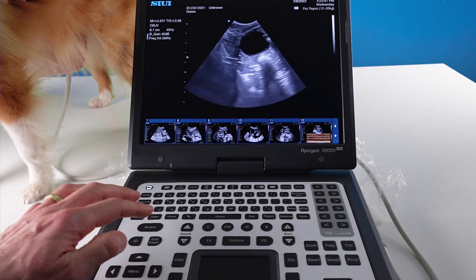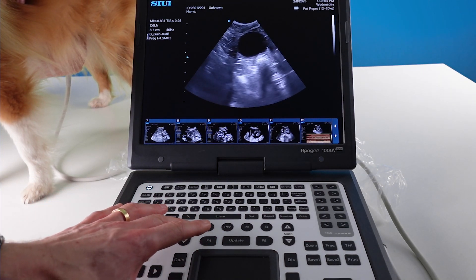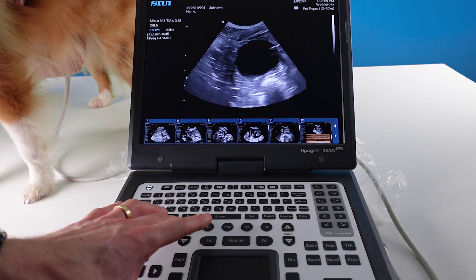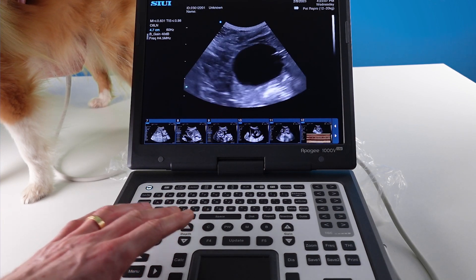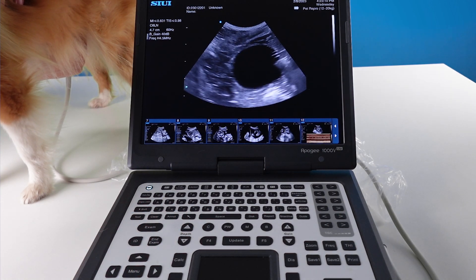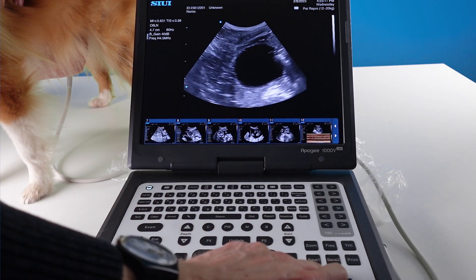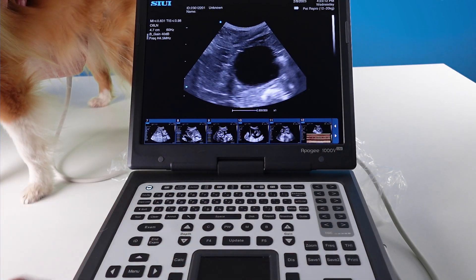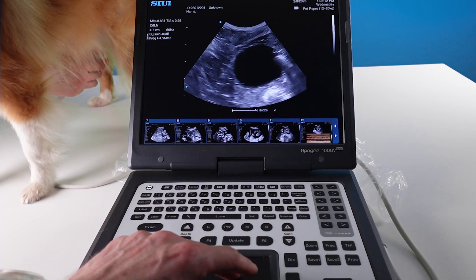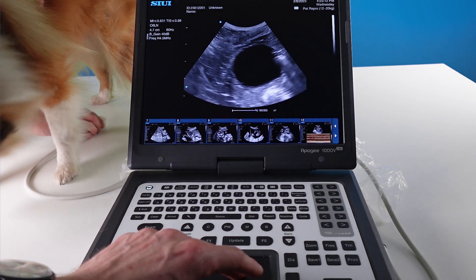Once you are in this exam type, make sure your focus is in the right position and reduce your depth to highlight the object you are going to measure. Freeze the image, and once you have frozen the image you can scroll to make sure you get yourself in the best place.